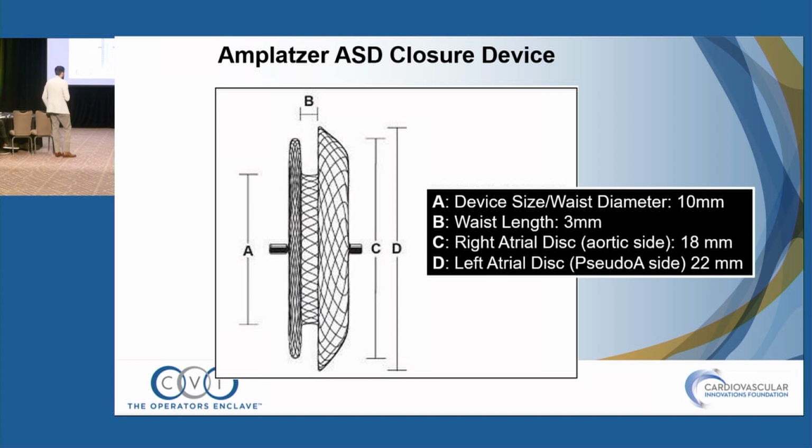And in the world of ascending aortic endovascular interventions, you can probably argue to do anything you want because there's no data, okay? There are no devices that are approved for use in this area.